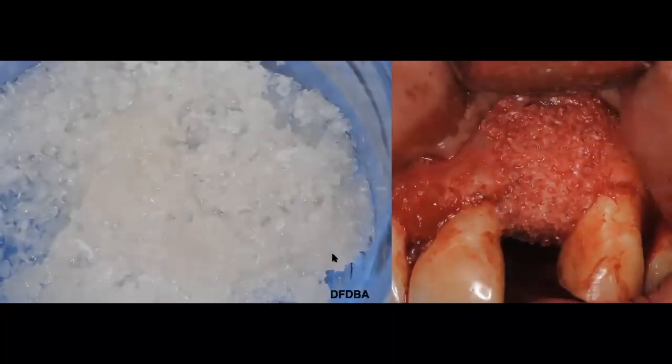So we're adding our bone, and we're using here demineralized freeze-dried bone, and we're going to have a mixture of 70-30 mineralized and demineralized bone. We're going to fill first the cavity, obviously the area where we were missing bone, where we had the cyst, and then we're going to go ahead and fill the entire area.